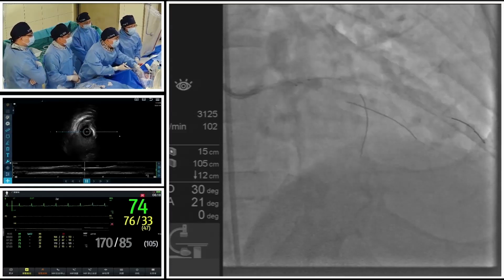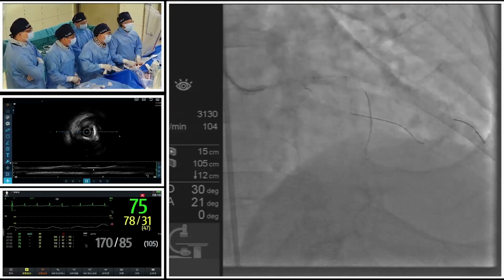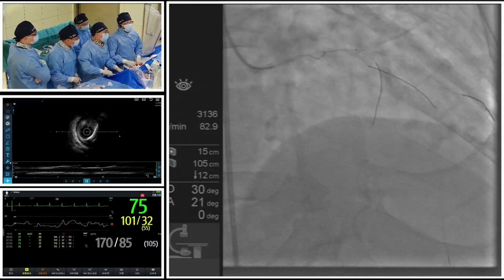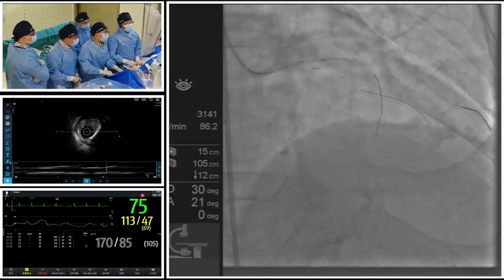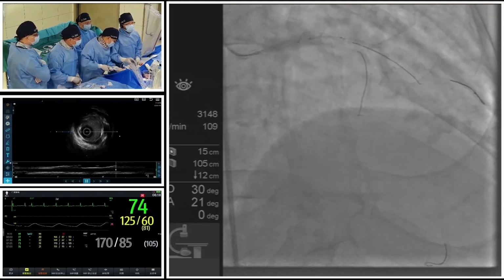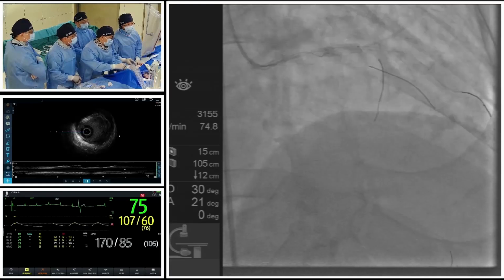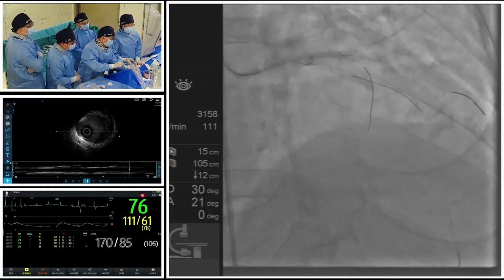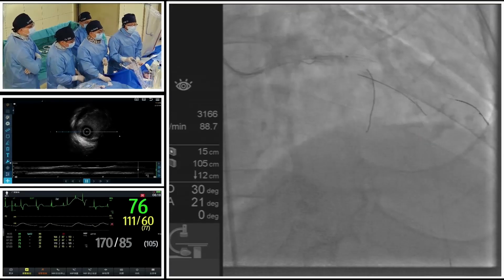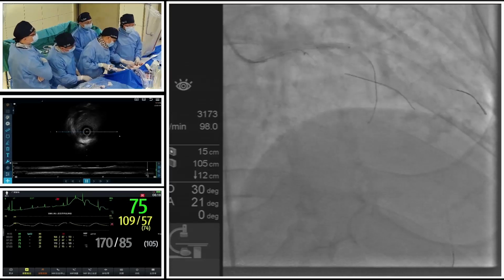I think one key advantage of the lithotripsy system is that it doesn't take a relatively long time or block the whole vessel for a long time, causing distal myocardial ischemia or severe chest pain or other symptoms. This is relatively friendly for the patient, especially for some very severe left main calcification, where we do not worry too much about the blood flow.